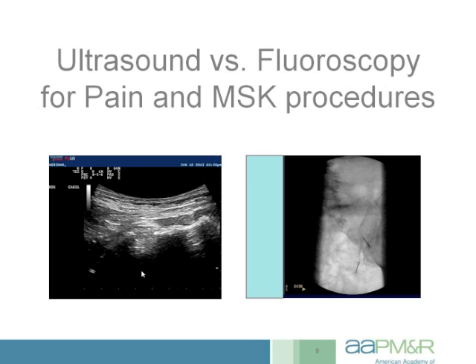If you needed to inject that under ultrasound, you could introduce a needle through the skin from either over here or over here and visualize that needle going into the joint. And if you're wondering what this is right here, if you're not real familiar with looking at the sacrum under ultrasound, this is actually a sacral foramen, and one of our lecturers will be talking about sacral transforaminals as well under ultrasound. And this is in contrast to a fluoroscopic view of the other side, of a right side.